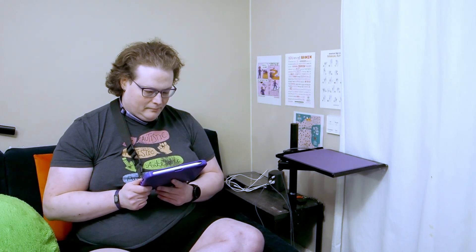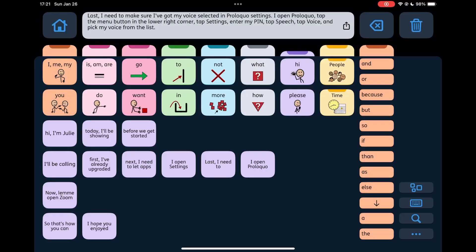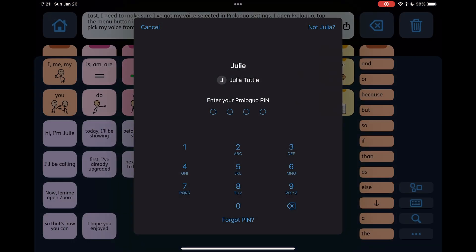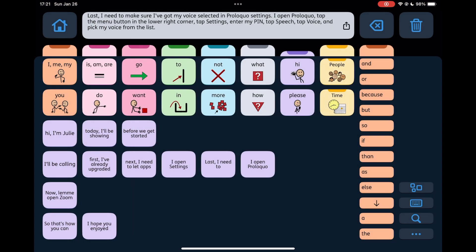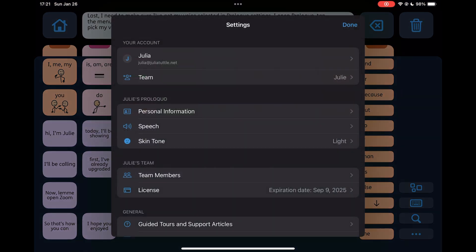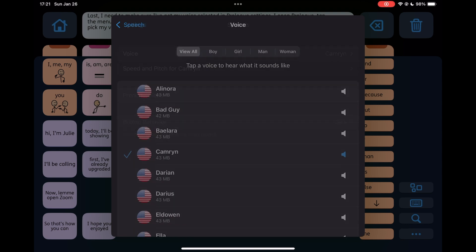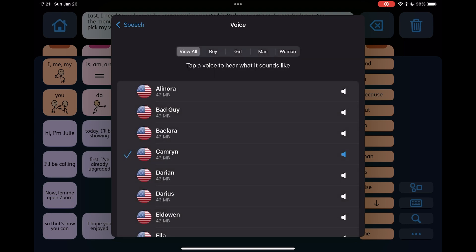Last, I need to make sure I've got my voice selected in Proloquo settings. I open Proloquo, tap the menu button in the lower right corner, tap Settings, enter my PIN, tap Speech, tap Voice, and pick my voice from the list.